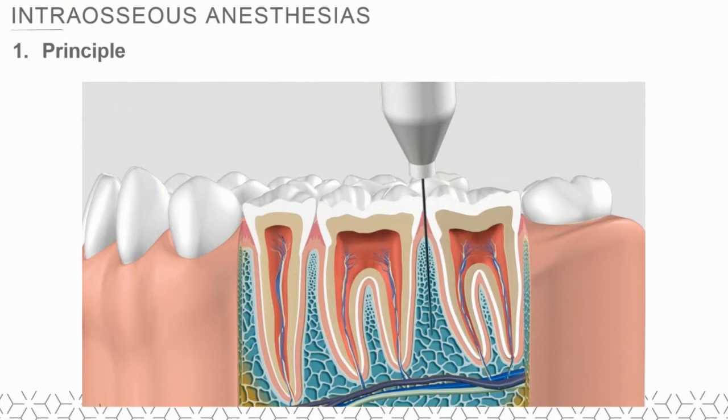The number of teeth anesthetized, the length, and the effectiveness depend on three factors: the injection site, the product injected, and the quantity delivered. By taking these three factors into account, it is possible to anesthetize from 2 to 8 teeth with only one carpule injected in one particular spot, with a lasting effect of 30 to 75 minutes.